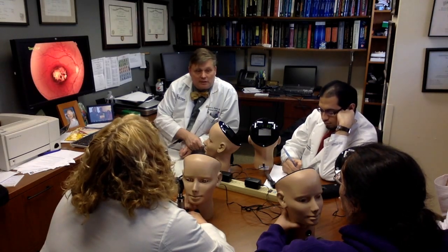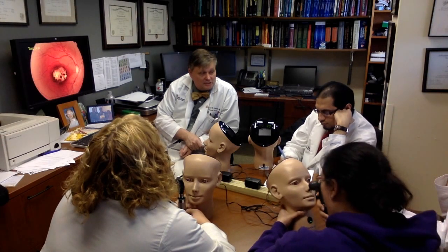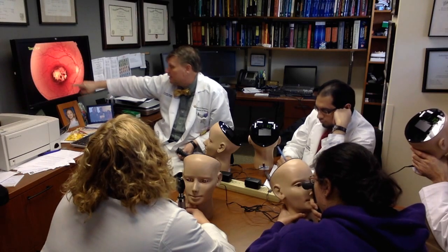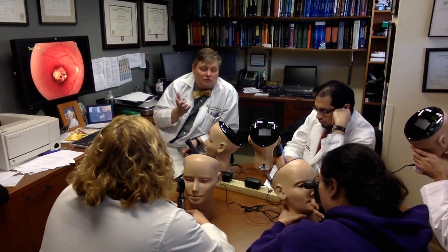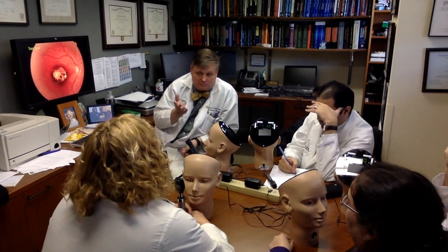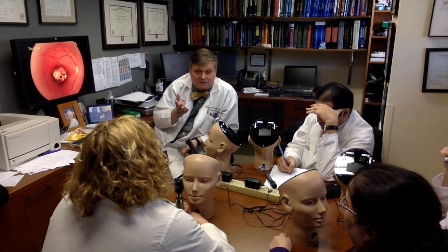Now, when you do pediatric neurology, you'll see what toxo looks like in the brain. But many times you can see it in the retina too. It tends to be circular or oval, well demarcated, tends to have a lot of pigment on the outside. The vision loss depends on where it is. Obviously, central vision is a big problem, but it may be totally asymptomatic. So this is what a toxo scar looks like.